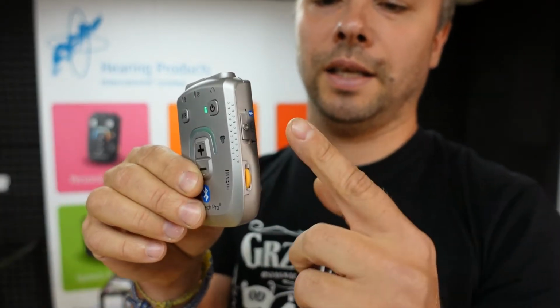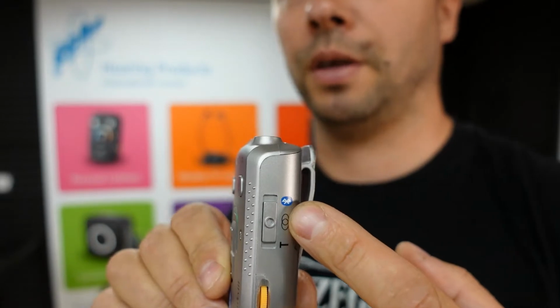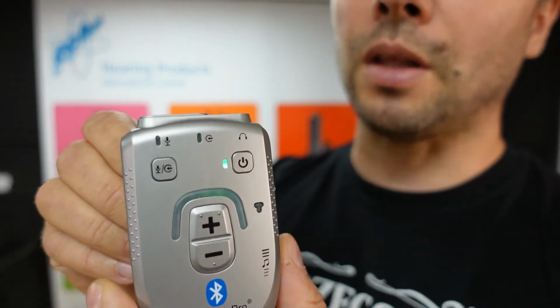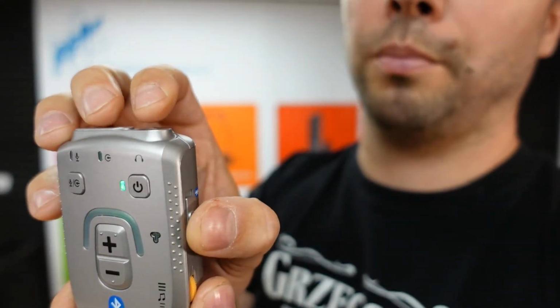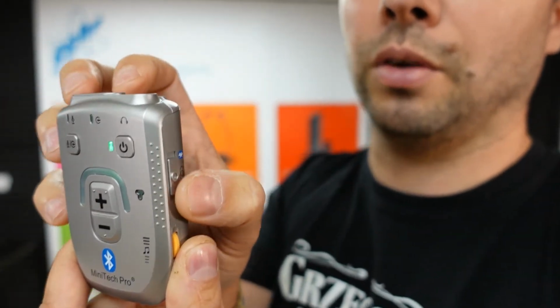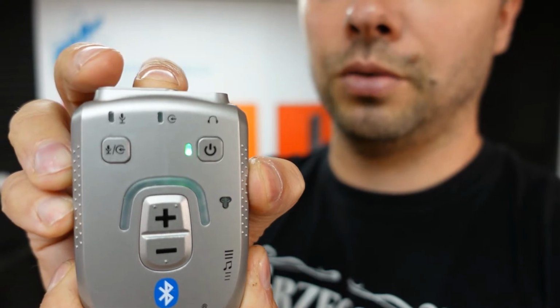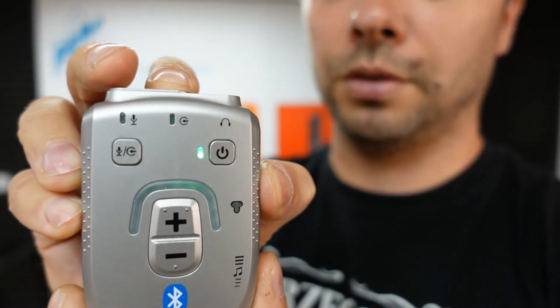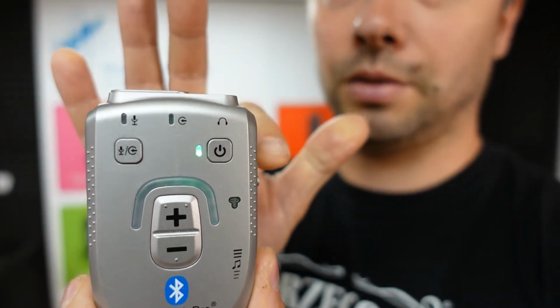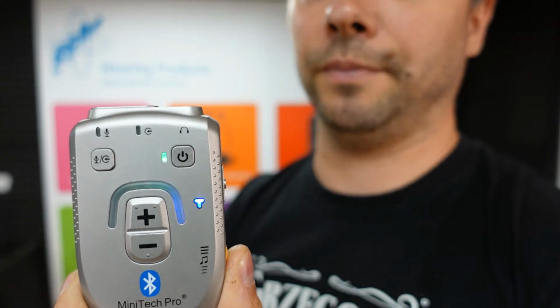Then locate the Bluetooth switch, which is right here. You can see the Bluetooth logo on top. So we've got a Bluetooth switch and the unit is on. Now we have to push up and hold the switch on the side for around 12 seconds, and you should see the LED start to flash slower. Now release the switch. So now the memory is cleared. It's blinking quickly now because the unit automatically went to pairing mode again.